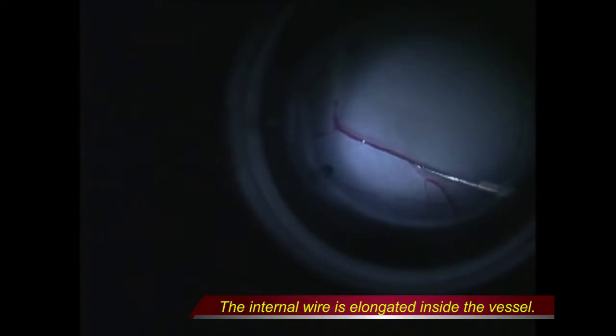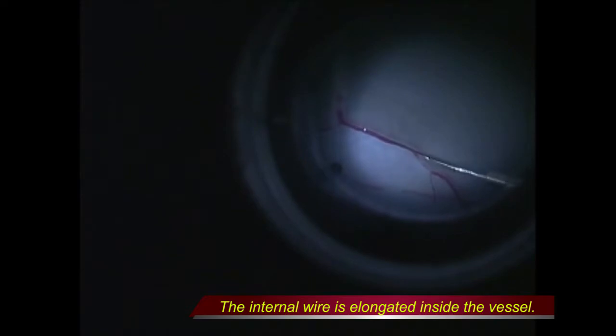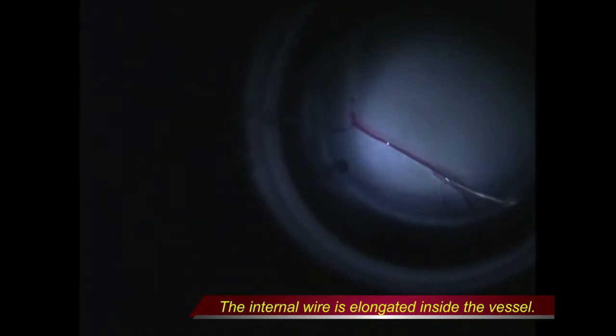Next, the surgeon held the instrument in a firm grip, making sure not to make any significant movement, and then projected the internal wire into the vein by sliding the projection on the side of the grip. The internal wire was elongated and advanced toward the optic disc without any distortion of the vein during the procedure.